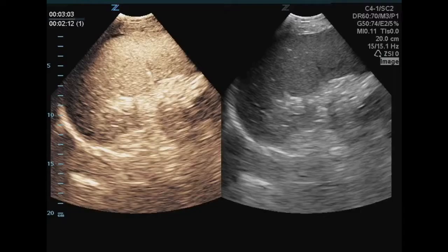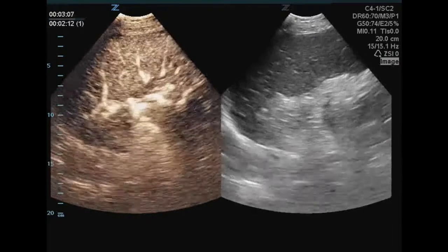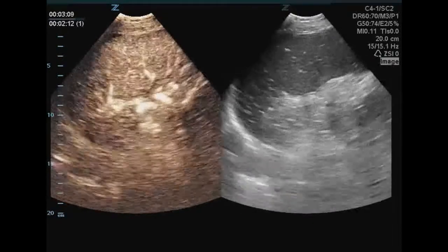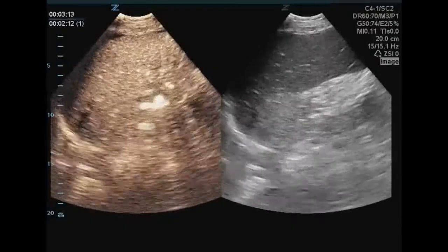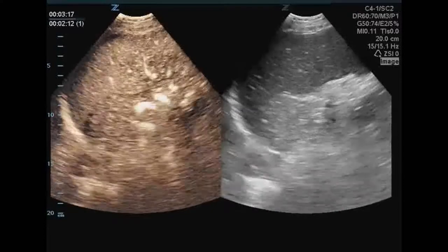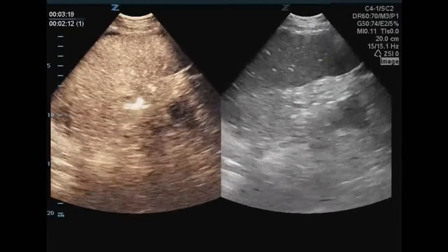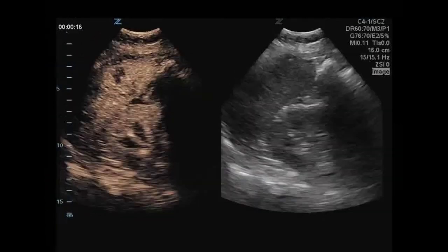All right? The other problem is contrast is dynamic imaging with ultrasound, right? CT is static imaging. So if I flash that kidney or that spleen, and you see that filling, remember, the spleen has red and white pulp, so that's going to enhance a little differently over time. So you can see that zebra effect in your spleen. We see that on CT all the time. Could be contrast mixing, may have laceration, unsure, don't know, re-CAT scan, right?